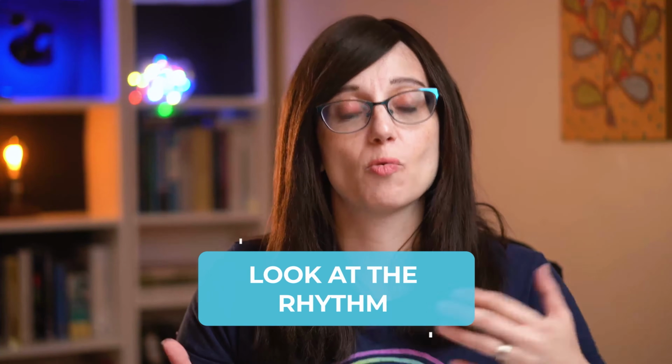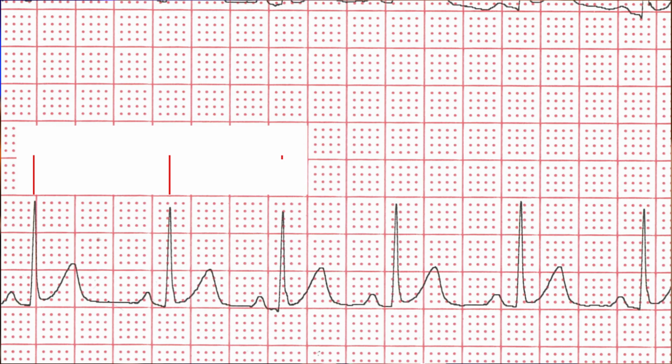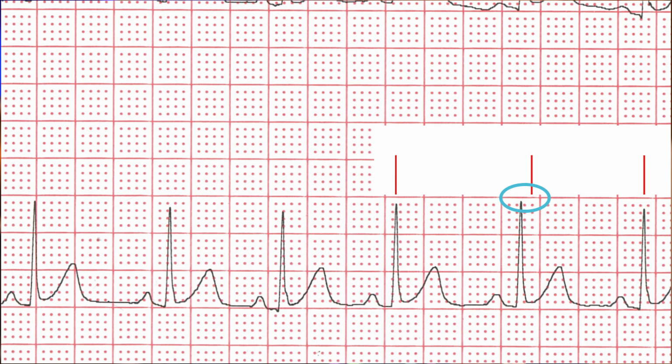Next, we're going to look at the rhythm, and what we want to know is: is this normal sinus rhythm? That's going to depend on two things, on the rate and then mainly on the P waves. So the rate needs to be a normal rate for age. Then we go on to look at the P wave. The actual P wave is made up of two waves, which is right atrial depolarization and left atrial depolarization. But because of the time that these happen in, they actually merge together and they form one P wave.